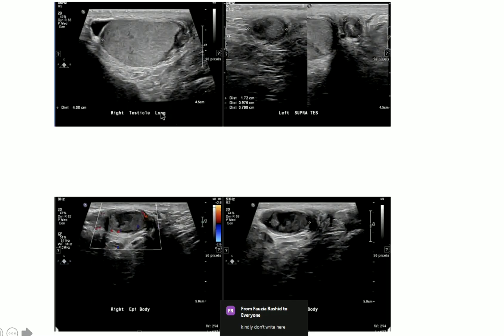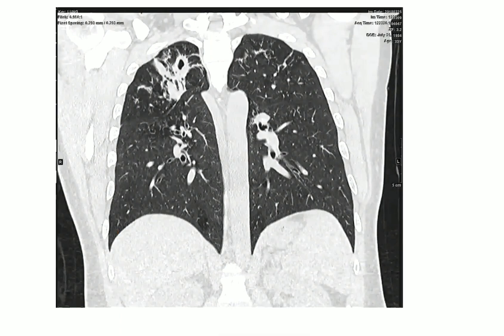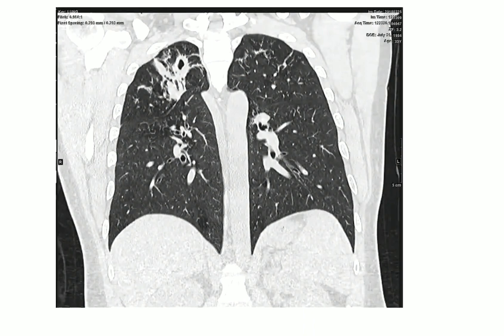Here we can see the right testis is normal, and this is the left supra-testicular — meaning extratesticular — area. The left testis is normal, and this is the epididymis showing the same finding. This is your chest CT that you asked for — a single shot from CT chest, lung window, coronal section — in which I can see apical fibrosis and a cavitary lesion with thick peripheral walls and central lucency in the right lung apex.